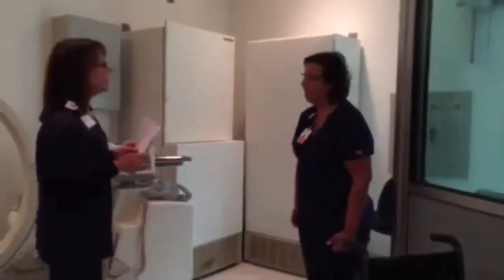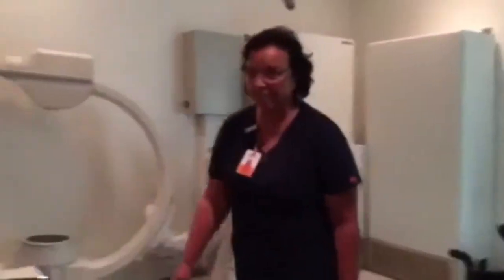All right. Mrs. DeWitt, are you ready? I'm ready. Okay, let's come on over here. I'm going to have you step up to this board with your back against the board, face me. Okay. Perfect. And I'm going to put a shield on you. All right, so I'm looking for your left shoulder to be in the center of that plate. There we go. Okay, and relax. My central ray is going to be entering an inch inferior to the coracoid process. And I'm going to have you just shift a little bit. Hold real still, right there. Good. All right. My left marker is in the field.